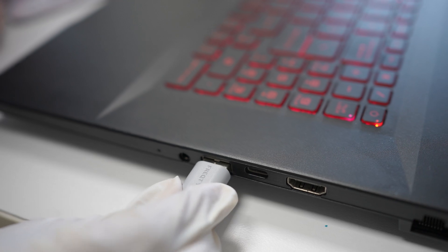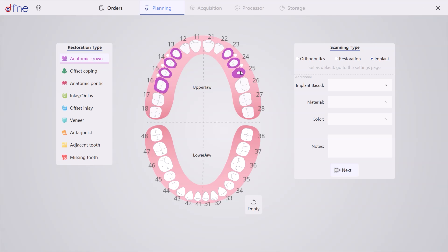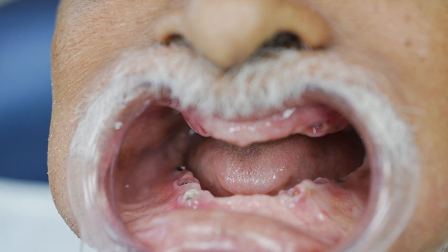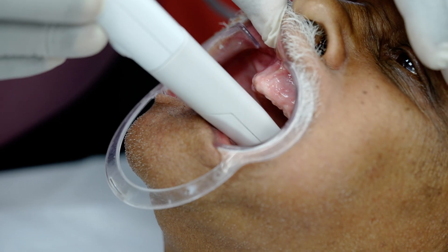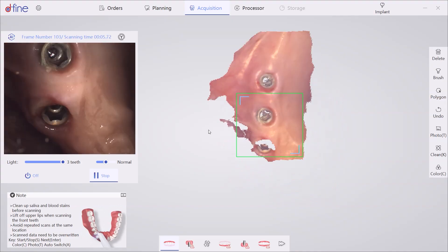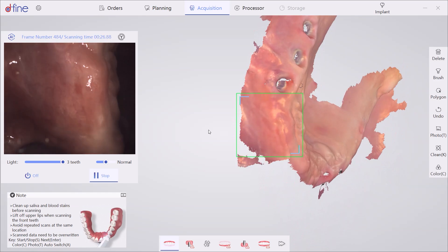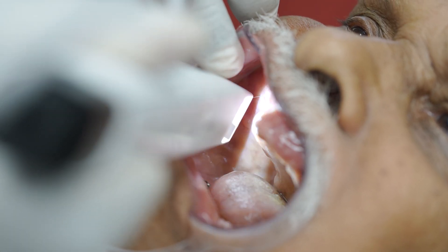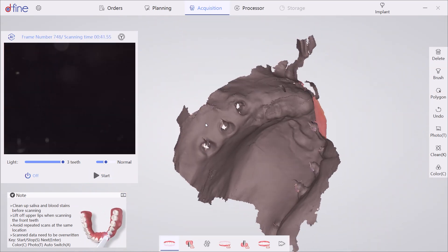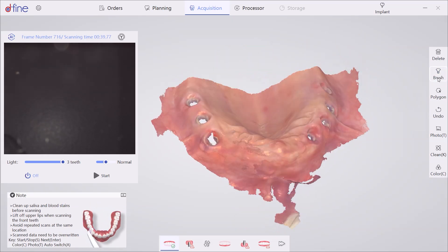First, set up the scanner and enter all the required details into the user interface. Remove the healing abutments from the implant sites to prepare for scanning. We will scan the upper arch followed by the lower arch. After scanning, trim and remove any excess or unwanted parts.